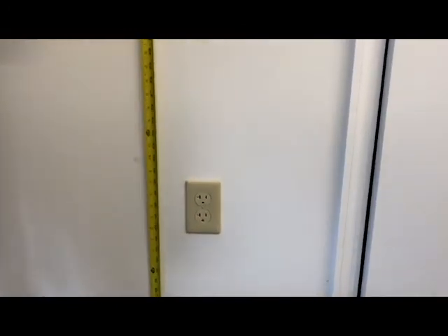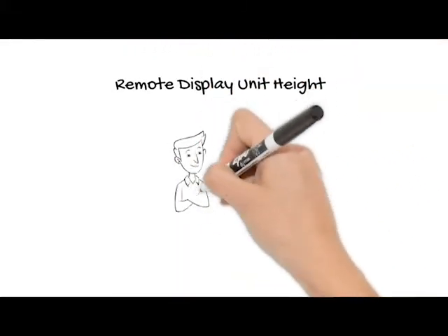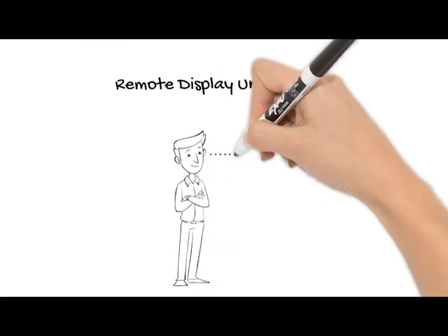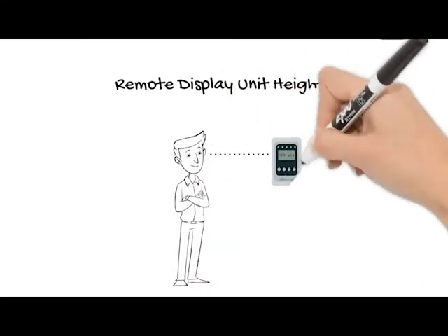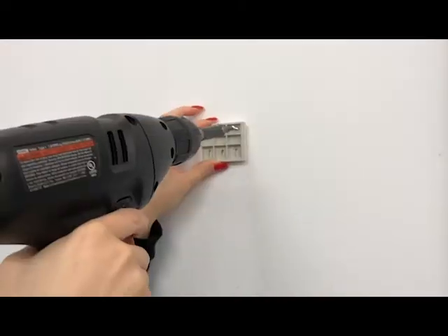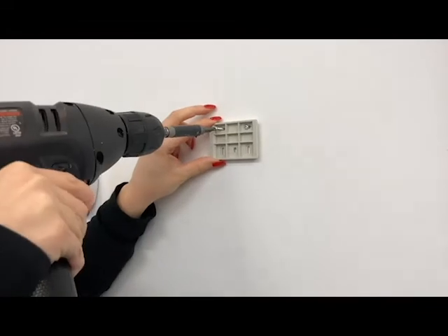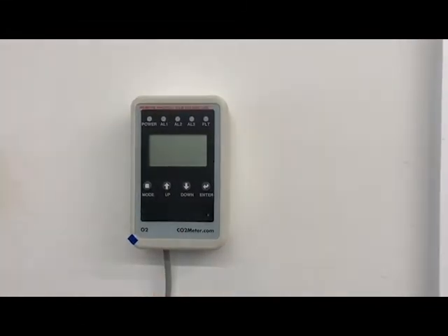To mount the remote display unit, choose a location outside the room where the main sensor is mounted. The remote display unit should be mounted to the wall at eye level so that you can easily view the reported oxygen levels. Repeat the steps to attach the second mounting bracket to the wall. And finally, slide the remote display unit onto the mounting bracket.